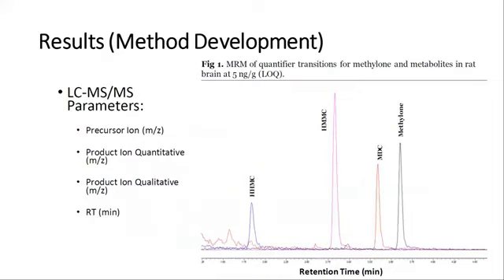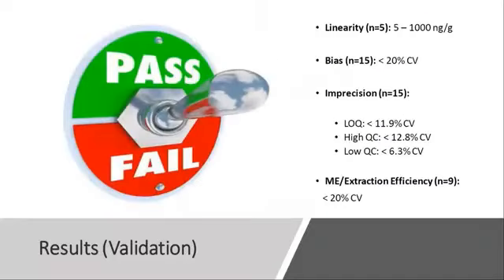So after analyzing the samples by LCMS-MS, we obtained results that indicated the distribution of ions by mass, as well as the retention time of each analyte, which is basically the time from injection to detection of the drug. This was translated into chromatograms that show different peaks for each analyte, and these peaks represent the retention time versus the intensity of abundance of each drug detected.